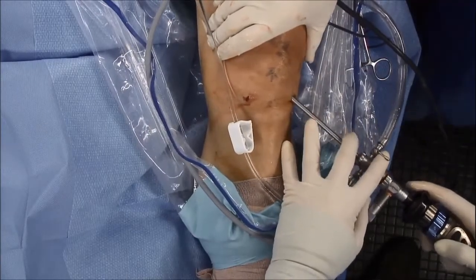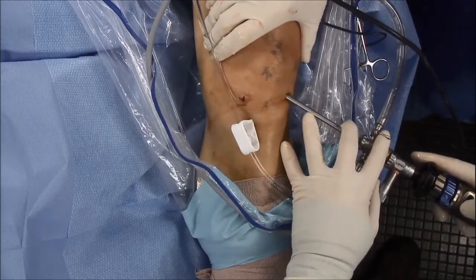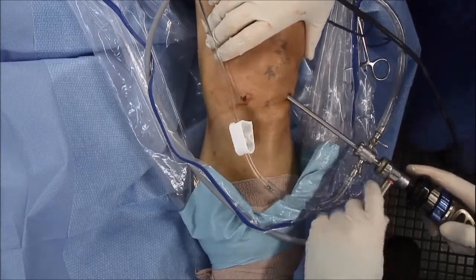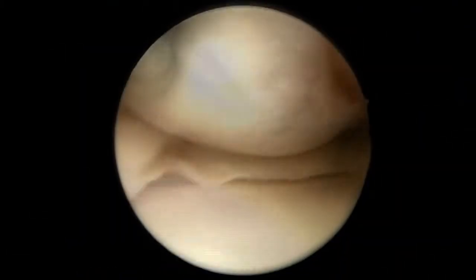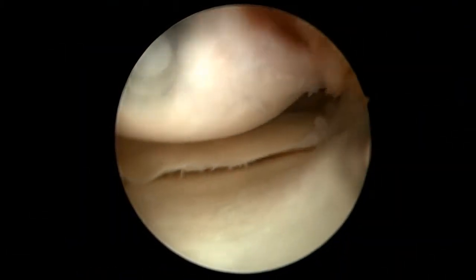The left knee is draped and prepped in the usual sterile fashion, and a standard diagnostic arthroscopy is performed through the inferiorolateral portal. At the time of arthroscopy, the femoral condyle, meniscus, and tibial plateau are evaluated.